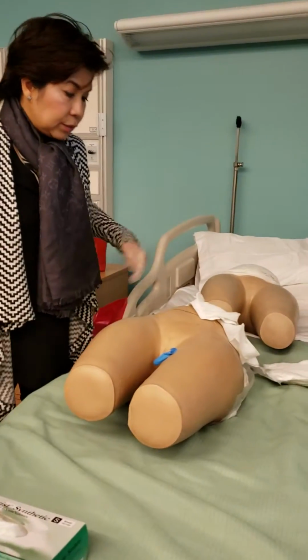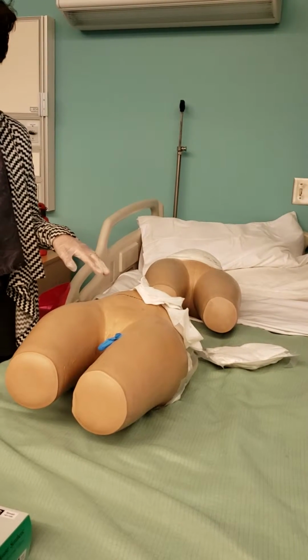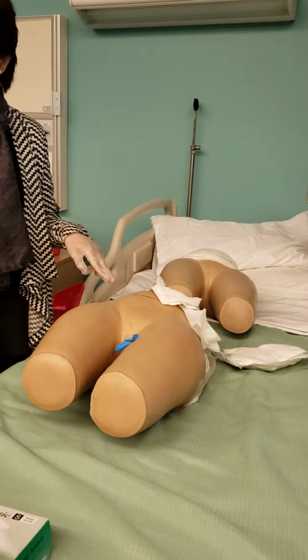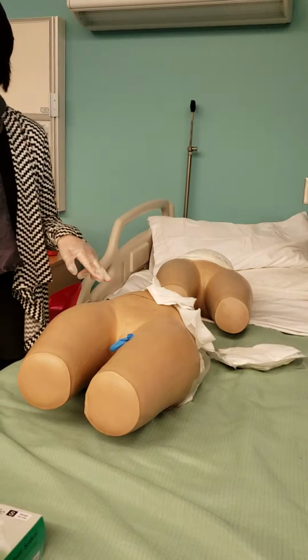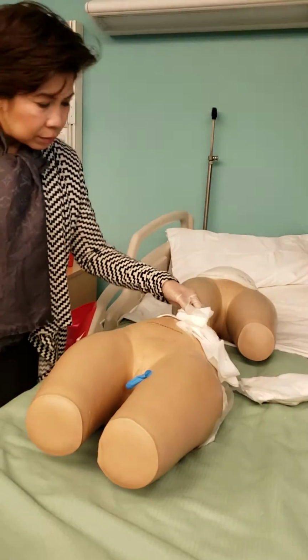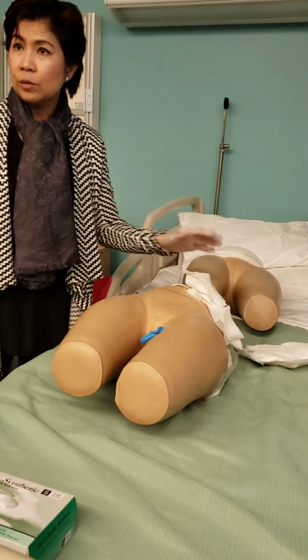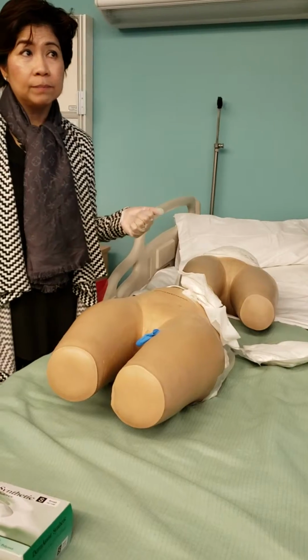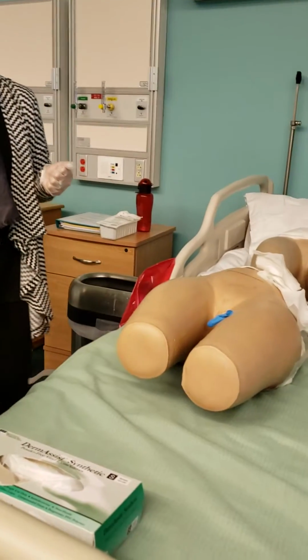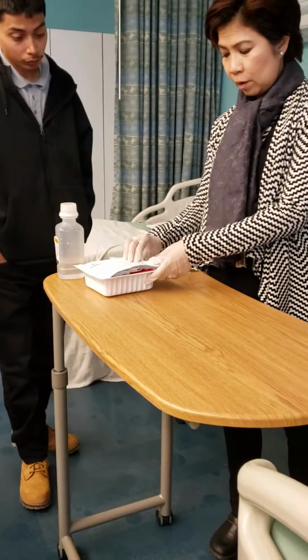So I looked at the incision also, and make sure that you're assessing the incision also. What I need to do now is make sure that nothing's wrong, it's not inflamed, nothing's coming out. If there's anything coming out, you're describing everything. So what I'm gonna do now is open up my change tray. Okay, I open it up.